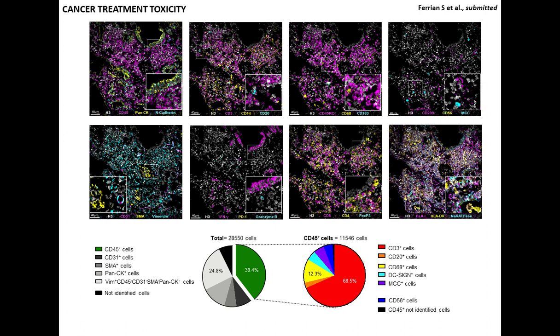So taken together, the striking features in this case study of PD-1-associated gastritis include lamina propria expansion by mononuclear inflammation characterized by CD4 and CD8 T cell infiltrates, lacking or with reduced expression of granzyme B and FOXP3 respectively. Epithelial injury from crypt apoptosis, intraepithelial lymphocytic and neutrophilic inflammation, as well as expression of interferon gamma by epithelial cells.